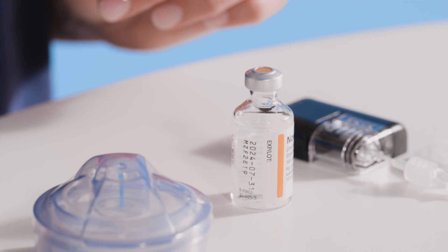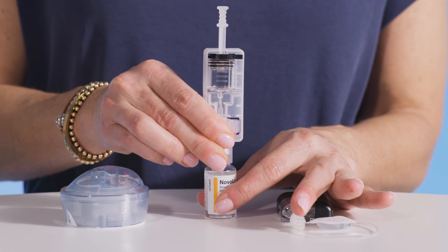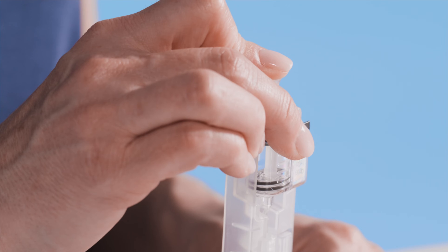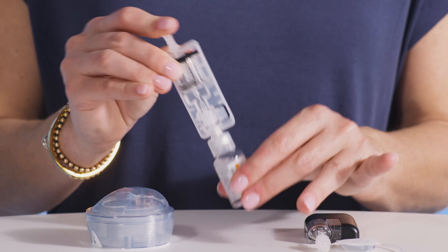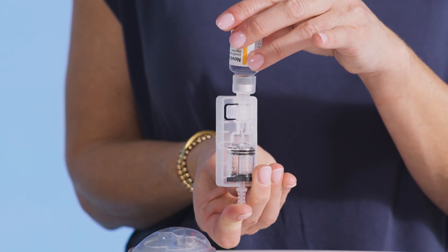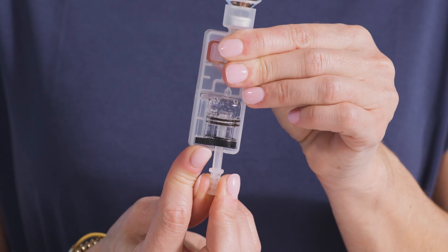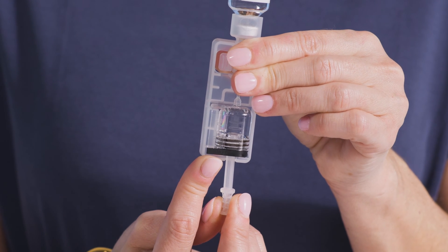Now it's time to fill the cartridge. Start by placing the insulin vial upright on a flat surface. Push the vial adapter down onto the vial. Next, push the fill rod down to force air from the cartridge into the vial. Be sure to maintain pressure on the fill rod. Then, turn the set with the vial still secured upside down and slowly release the fill rod. Insulin will begin to flow from the vial into the cartridge. From here, you can slowly pull back the fill rod to the desired amount of insulin. Keep in mind that there must be at least 30 units of insulin remaining in the cartridge once the tubing is filled.